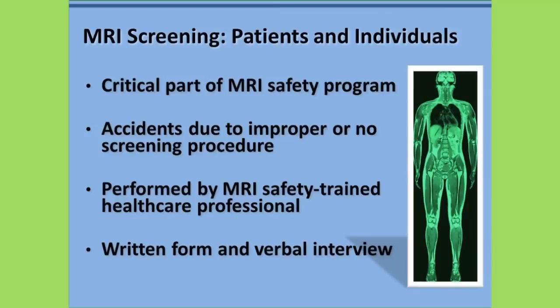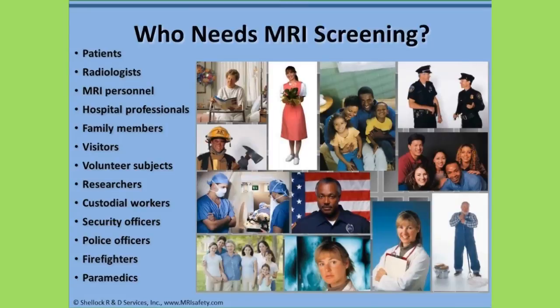Proper screening involves the use of a written form and a verbal interview that are designed to identify health conditions and other items, such as implants, that may pose safety or other related problems. So exactly who needs to undergo MRI screening? Well, basically, anyone who will encounter the MRI setting, and that includes patients, radiologists, MRI staff members, family members and visitors, research subjects and volunteer subjects, as well as many others.